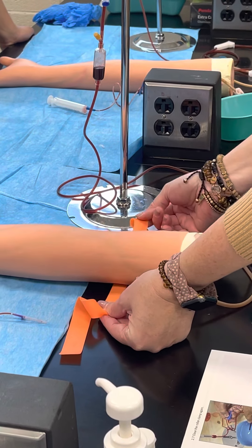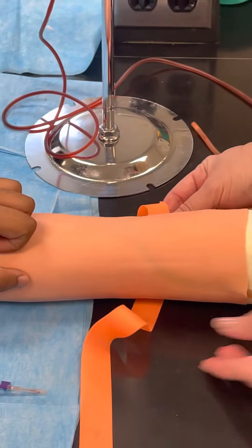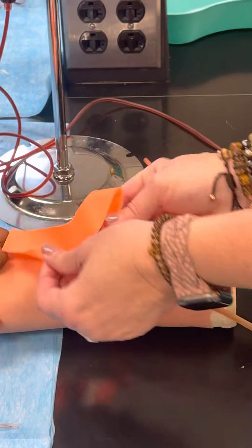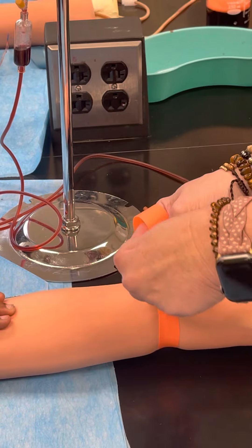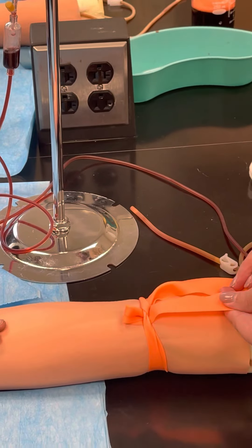Can one of you hold the arm steady while I do this? I'm gonna have my hands close together — I'm holding my fingers close together — and I'm gonna wrap it around and switch hands. Then the top string gets tucked under like you're gonna start tying your shoes, but you don't push it all the way through, you just tuck it under.